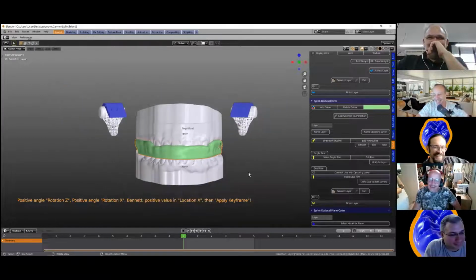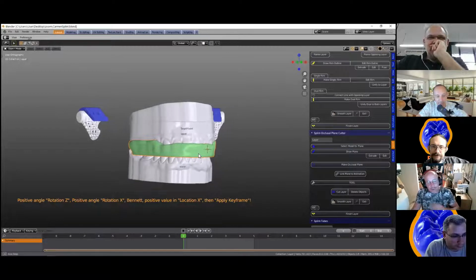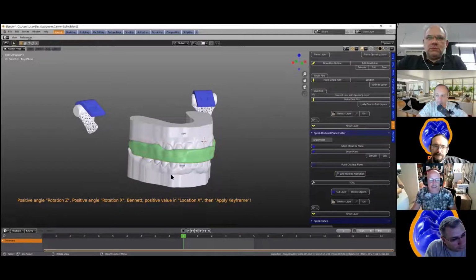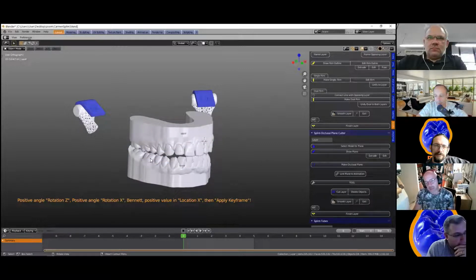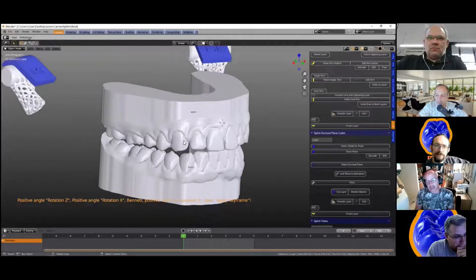All right. Okay. So here we've got an animation of a splint. Now I've seen quite a few people that design splints, and there's this preconceived thing about splints that they should only go one third of the tooth length. And our question is, we've made hundreds or thousands of splints in a lab, and splints need undercut.